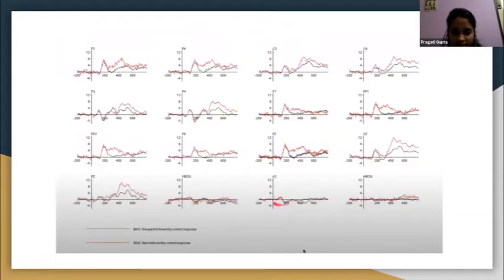Then we can also see these activities, which are not much activity because we don't want the averaging of all these. So these are some of the parameters. And in pre-processing, if you're seeing these types of waveforms and they are much noisier, we can also change the reference site. If you want to change the reference site from vertex to the average of all electrodes or the average of mastoids, we can do that. You can see, we can play with the data set, like what variations there are.